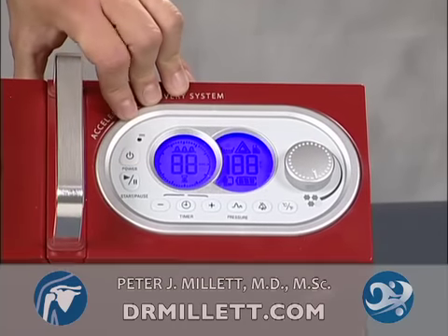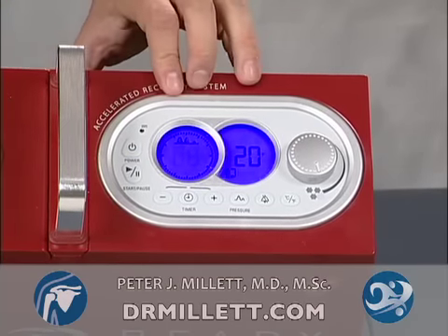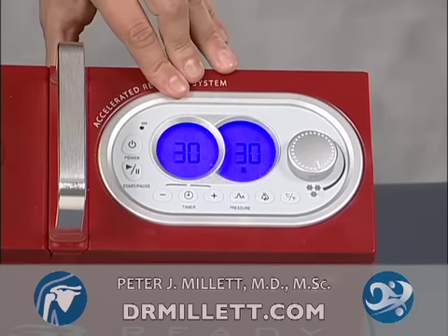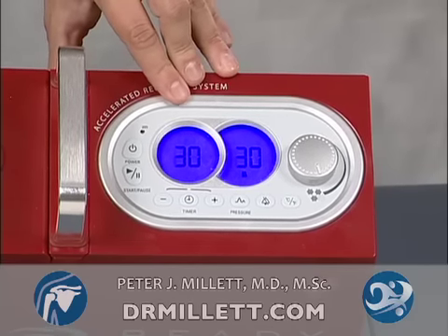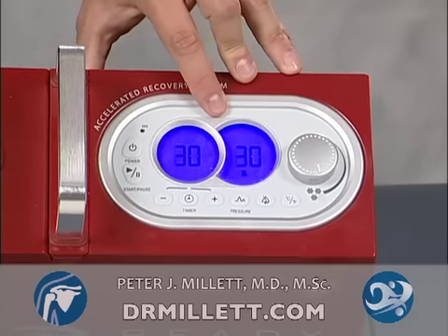By pressing that, the Game Ready will turn on, run through a self-test, and default to a 30-30 mode. 30-30 mode means that the unit will apply pressure and ice for 30 minutes and pause for 30 minutes. It will run through this cycle for 4 hours.